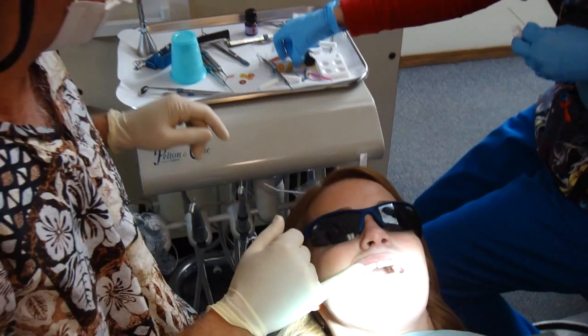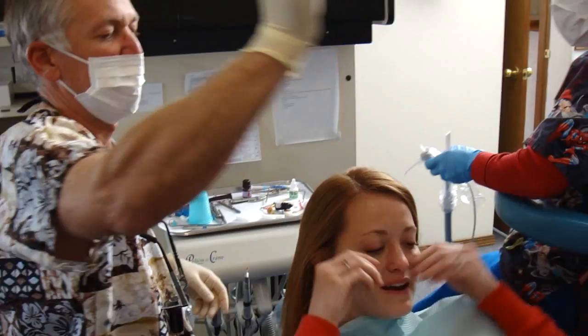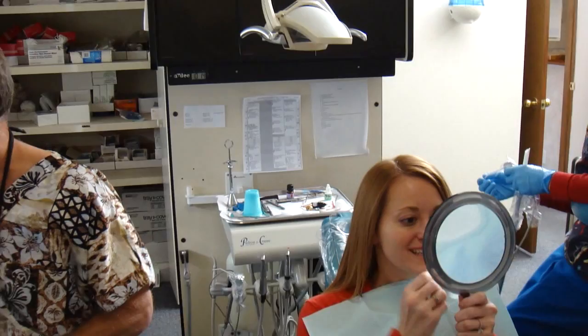All right, so we bonded three of the four veneers on, and we're going to bond the last one on. Okay, take your protective eyewear off, and I'm going to sit you up. And those are thin and they won't come out — you can eat apples, and really there's not really a limitation there.